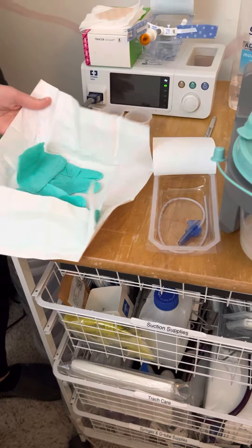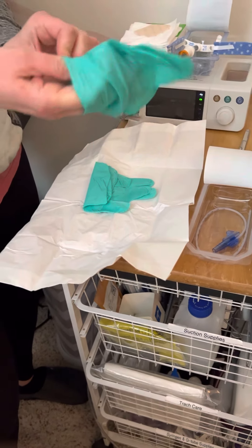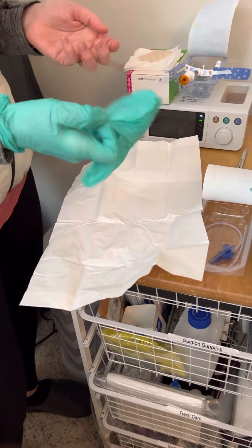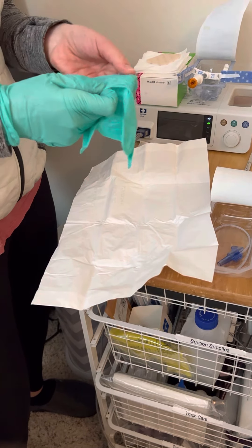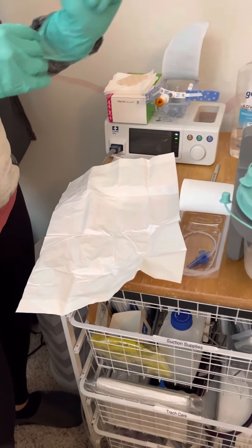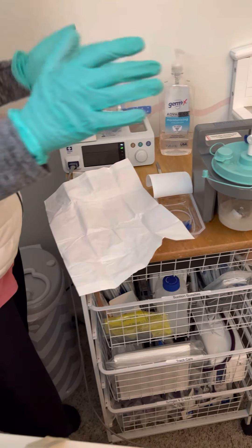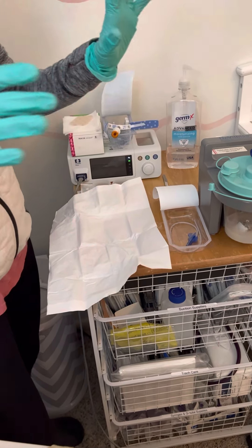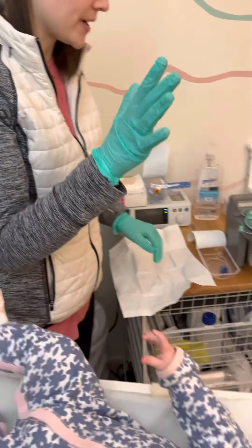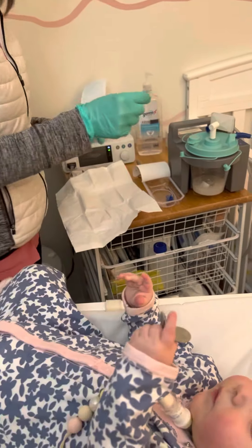You open your gloves and put them on. I will put them on sterilely — you don't have to, but that's the hardest part if you don't know how. What you want to think of is having one hand as clean and one hand as dirty. One hand you'll touch other things with; the other hand you're only going to touch the suction catheter with, so it's as clean as possible and we're not introducing anything into her trach.